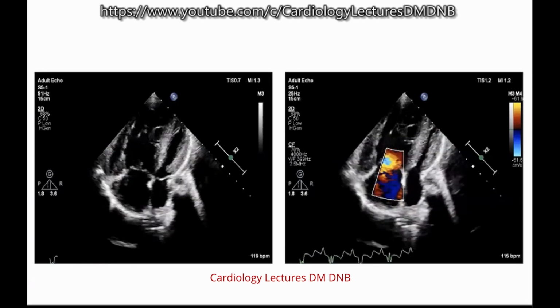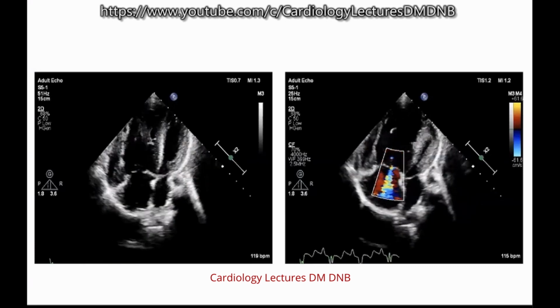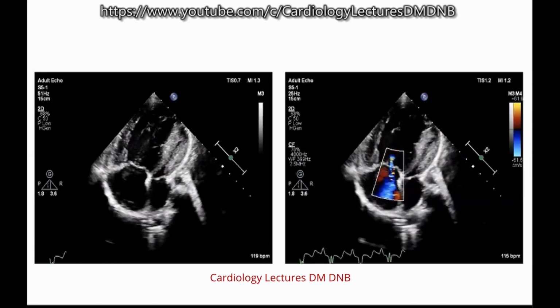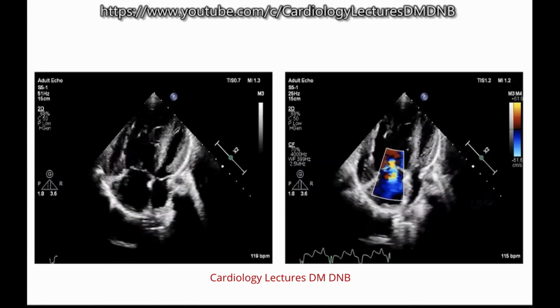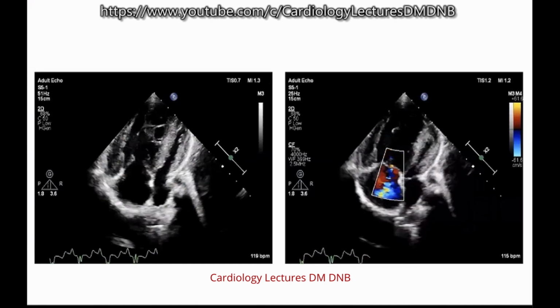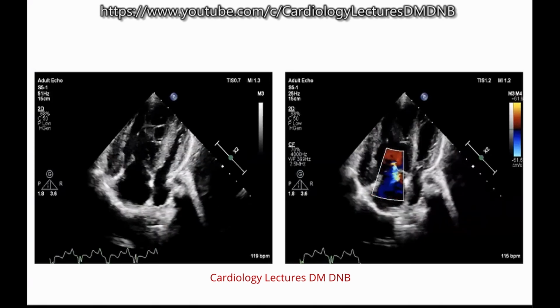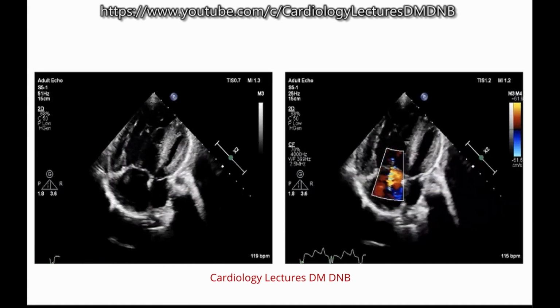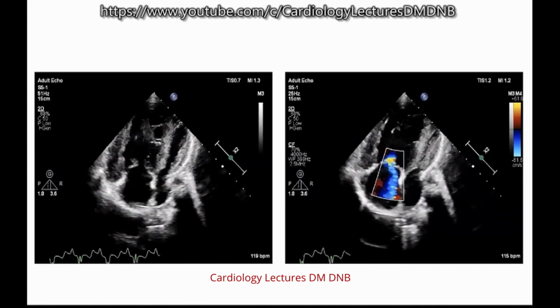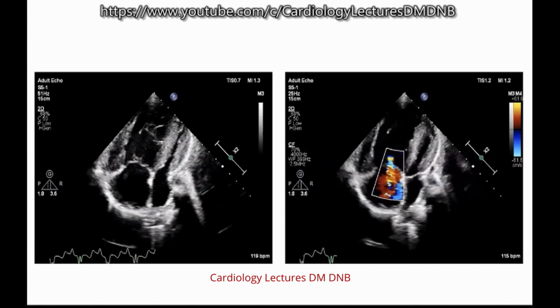So we see the apical four chamber view, significantly dilated right atrium and right ventricle with RV hypertrophy and TR jet, which is at least moderate in intensity. You could also talk of the RV function in the same breath. RV function appears to be reduced. Yes, it is quite reduced. It's the rocking movement of the heart and not really a contraction. This is highly underfilled. LA and LV are highly underfilled.